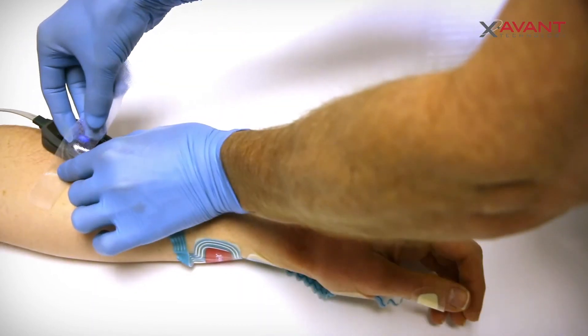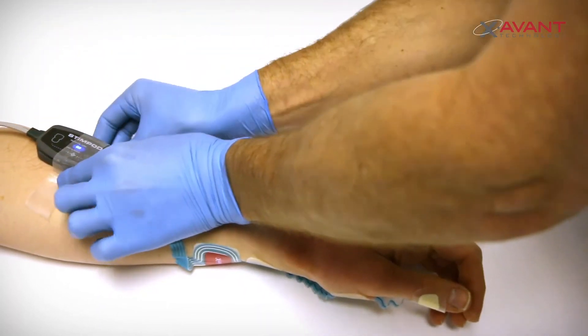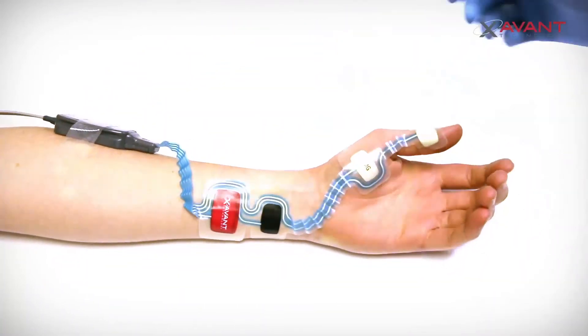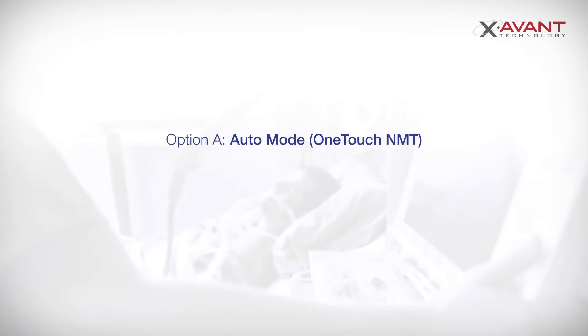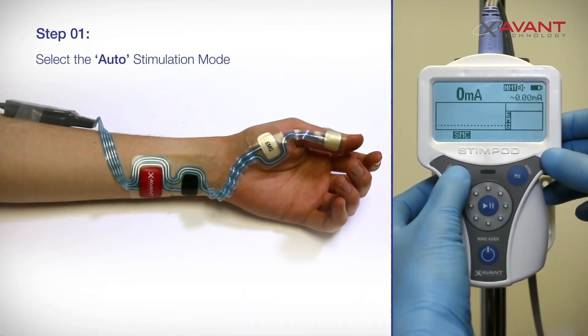Secure the cable to the patient's arm in the most convenient location, preferably on the outside of the patient's forearm. You can now proceed with NMT monitoring by choosing either of the following stimulation options. Option A: Auto Mode — use the mode button to change the stimulation mode to auto mode.